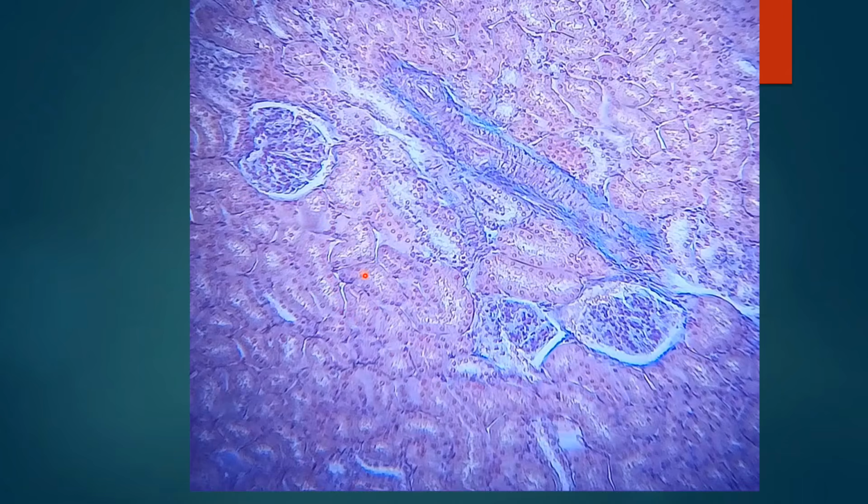Their lumen is not clear. They show dark eosinophilia and the cells are larger as compared to the cells of the distal convoluted tubule. These are the smaller cells and they have less eosinophilic cytoplasm. This one is the distal convoluted tubule and these are the proximal convoluted tubules.